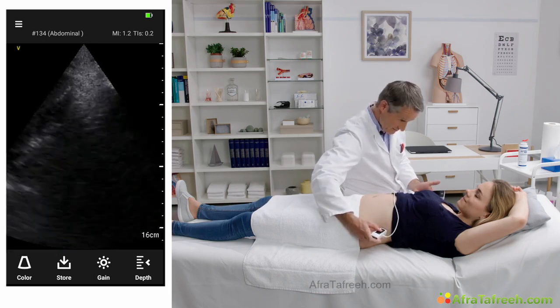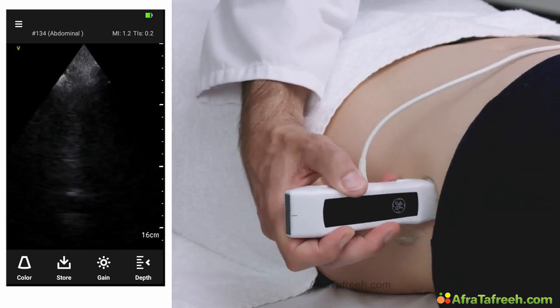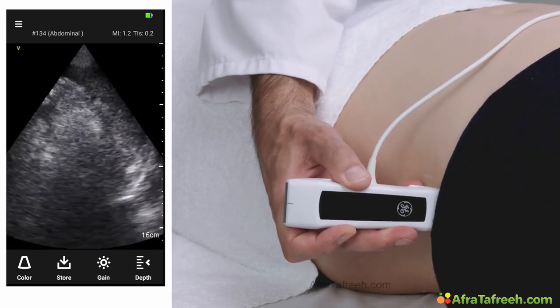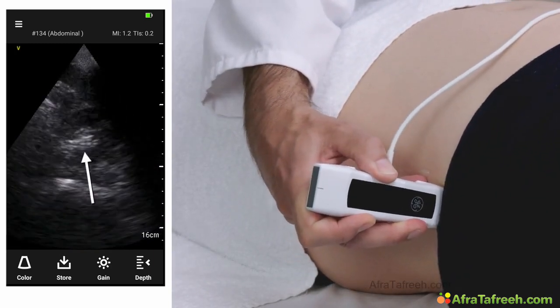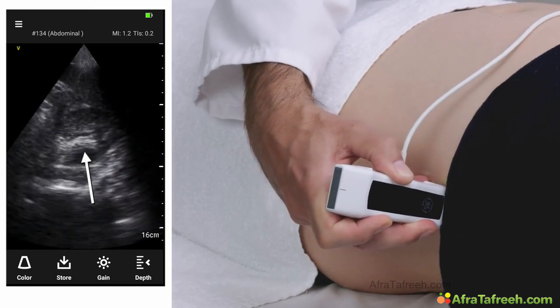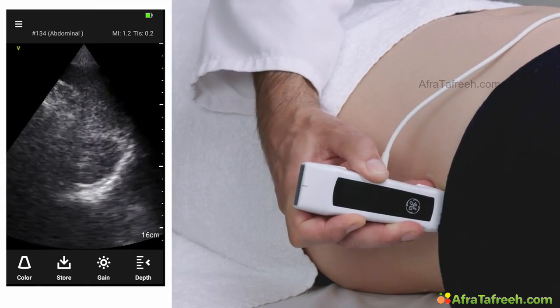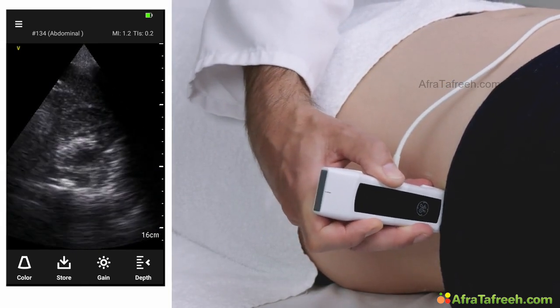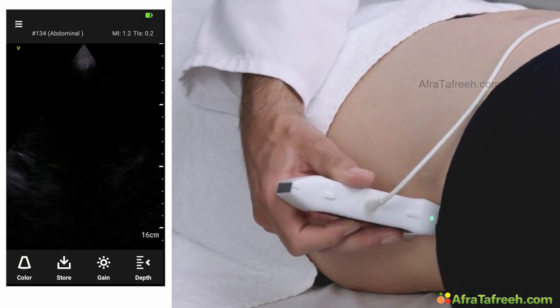And exhale. Now we turn the probe 90 degrees counterclockwise. Please inhale deeply. And here, the same thing in the transverse view. We tilt the probe caudally and cranially and have a nice view onto the entire kidney. And exhale. Thank you very much.